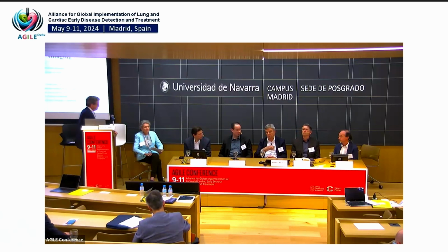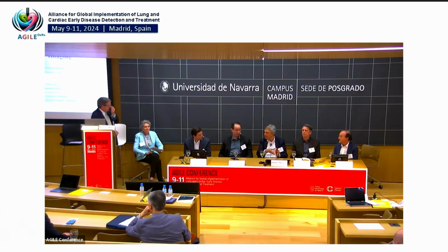We could, in a certain region, hypothesize for further research that when we want to get rid of this random noise clustering, we would like to have a threshold where this is not happening anymore. So then you are referring to size. And we know, of course, it's also extremely sensitive to the threshold. In the literature, you have applications from minus 950 to minus 960, something like that.